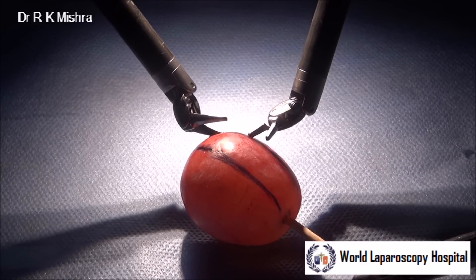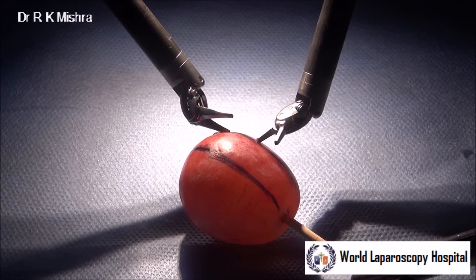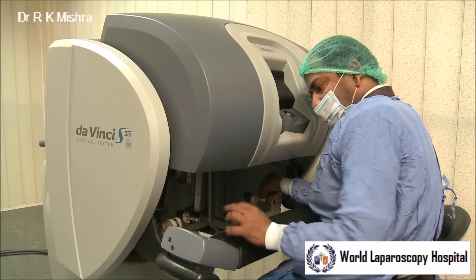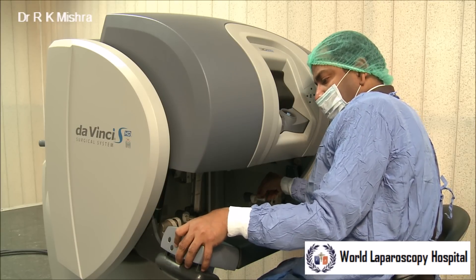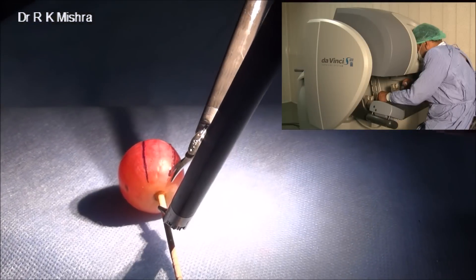The micro scissors of the EndoWrist instrument, as you know, can move in any direction without tremor and with extreme precision. You can keep to the ultra-fine mode — the motion scaling here has been changed to ultra-fine mode — and then it cuts precisely on the lines.